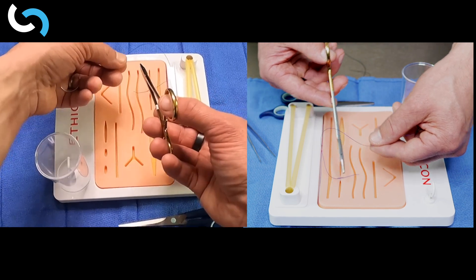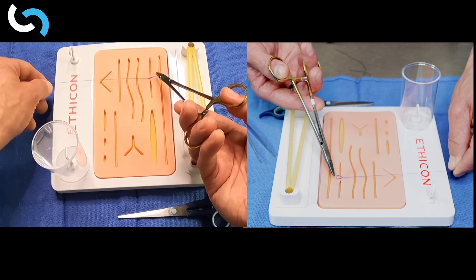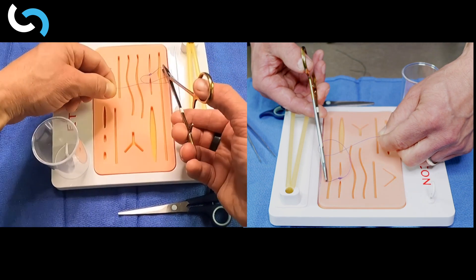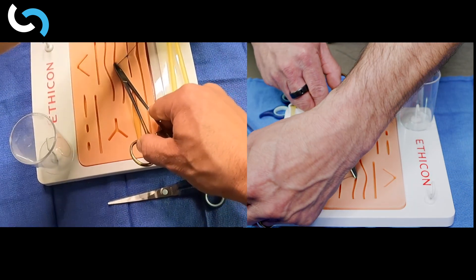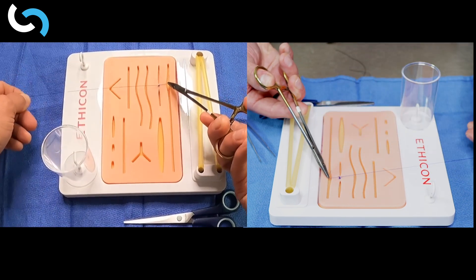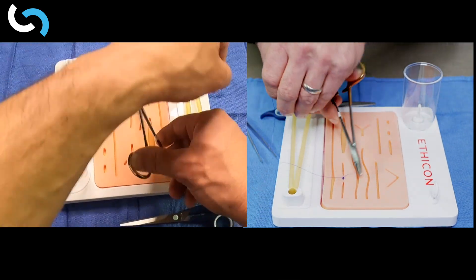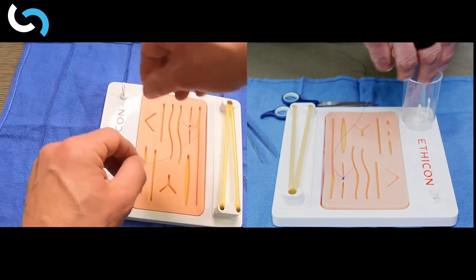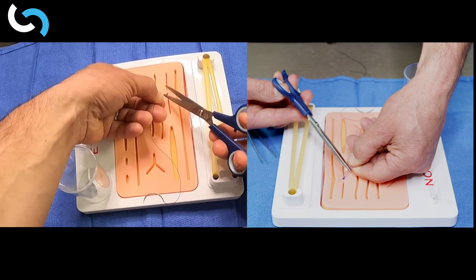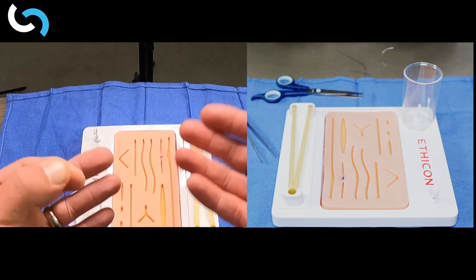Our loop is ready and we go back through, crossing our hands again to complete that square knot. We finish by doing a third throw, crossing the hands, and because this is a monofilament suture, I'll do a fourth and then a fifth so that the knot is complete and completely square. When we're finished, we grab our scissors and trim, leaving about three millimeters of suture. That's a completed knot.